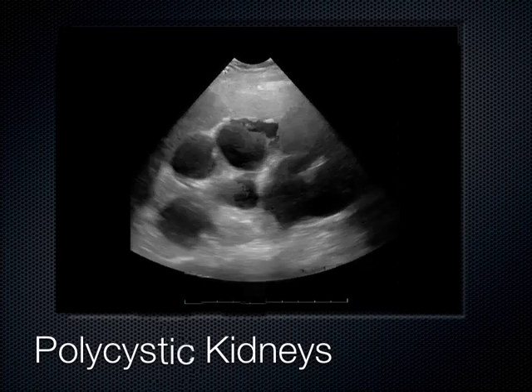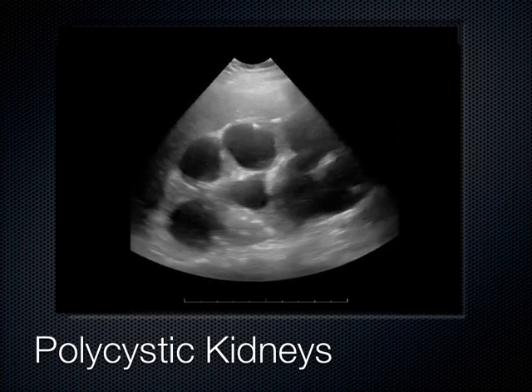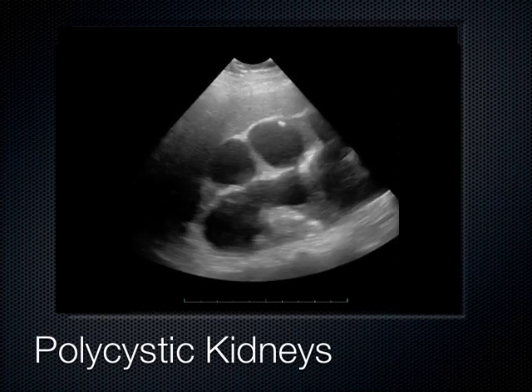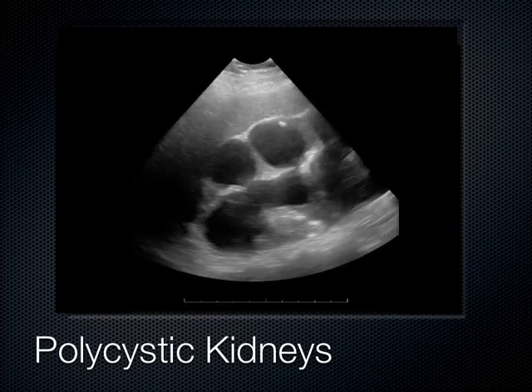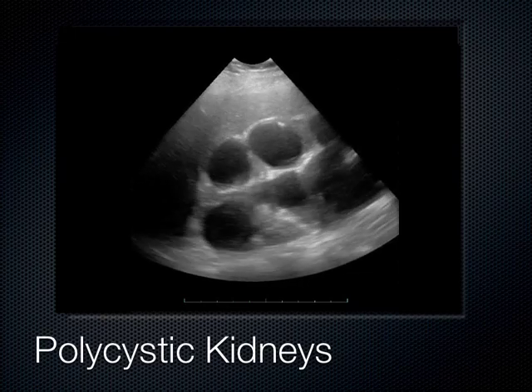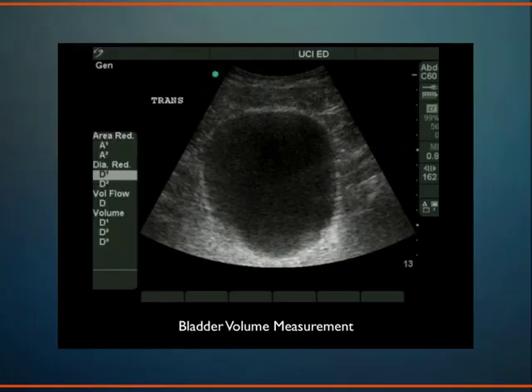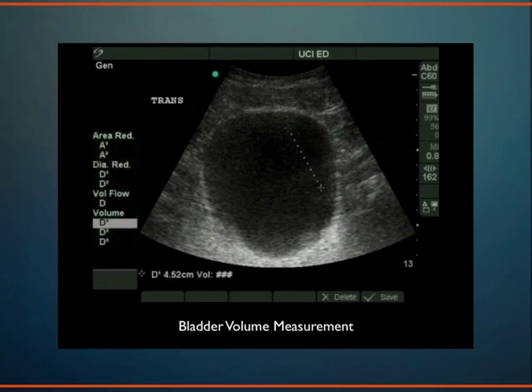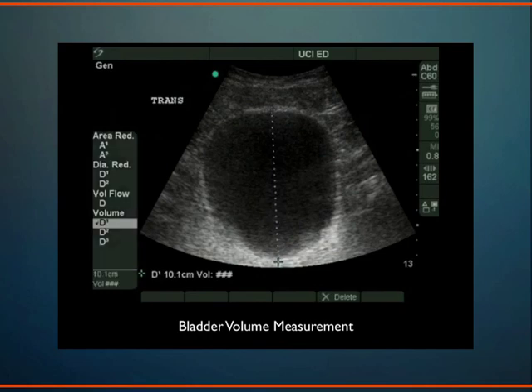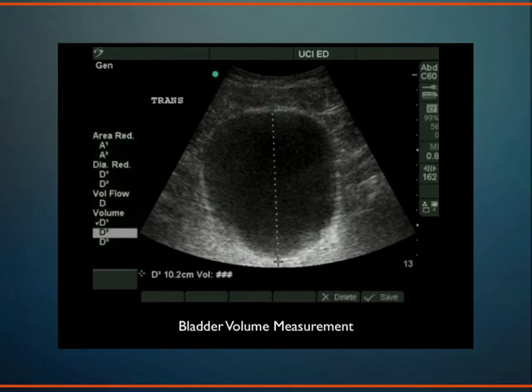If the kidneys are functioning normally and pumping urine into the bladder, we can measure how much urine is in the bladder on ultrasound. We look at the bladder in two dimensions and measure all three dimensions to estimate bladder volume. With the probe in a transverse plane, indicator to the patient's right, we measure height and width — going from one edge of the bladder to the other.